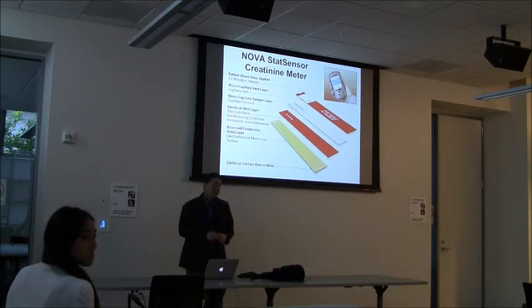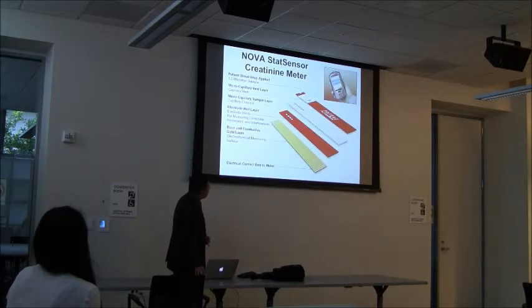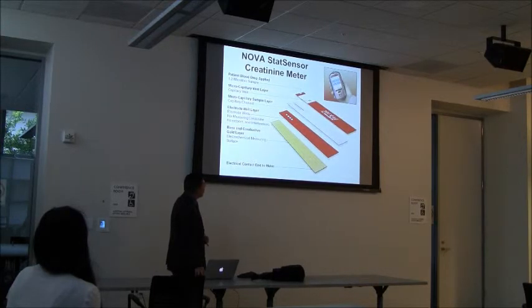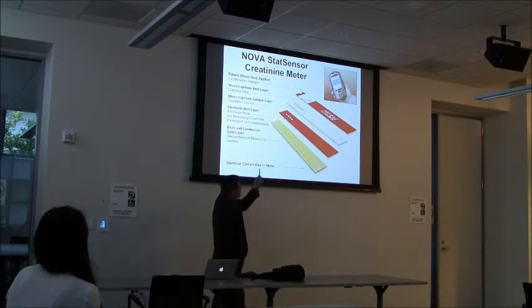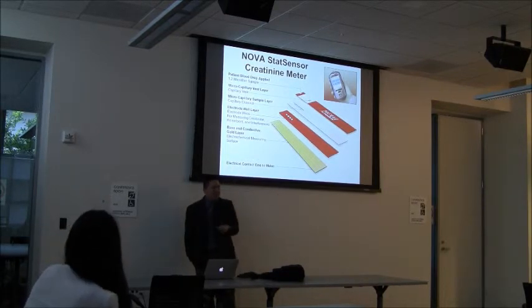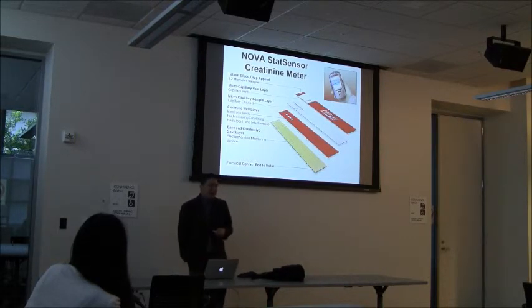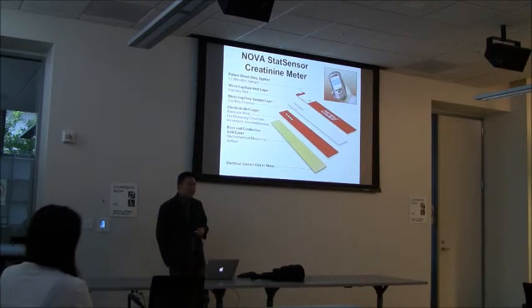And how much does the reader cost? The reader depends. I think this guy's probably about $5,000, and this one's probably about $300 or so. And then there are smaller ones. The model for this, though, especially for home use, so you see glucose meters on TV where they advertise it. They actually sometimes just give it to the user. Here's a free glucose meter. You just buy our strips. So it's the inkjet model of medicine in this case.